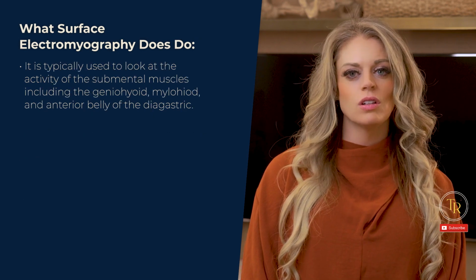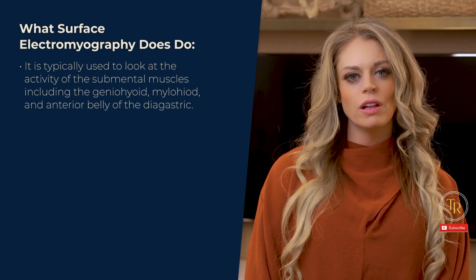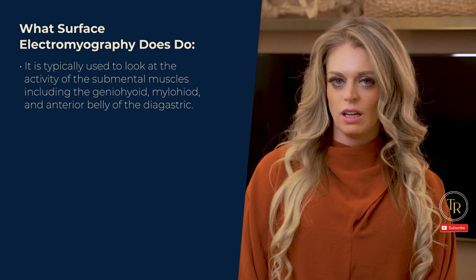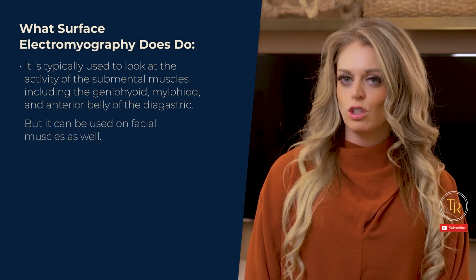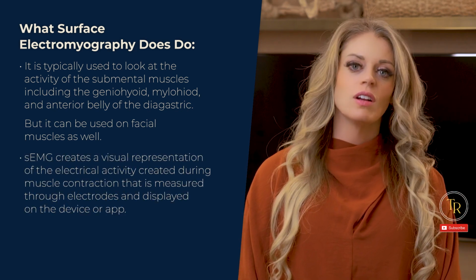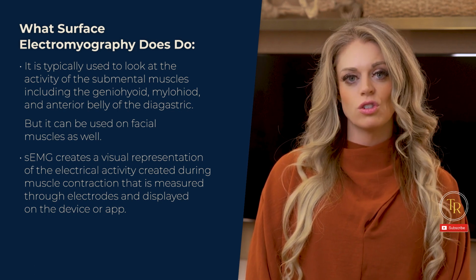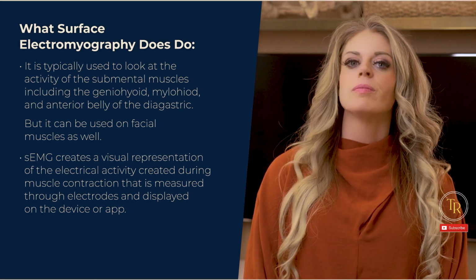It is typically used to look at the activity of the submental muscles, including the geniohyoid, mylohyoid, and anterior belly of the digastric, but it can be used on facial muscles as well. sEMG creates a visual representation of the electrical activity created during muscle contraction that is measured through electrodes and displayed on the device or app.